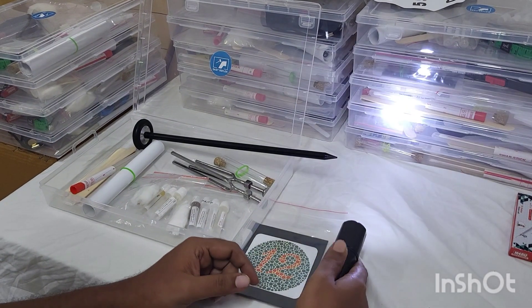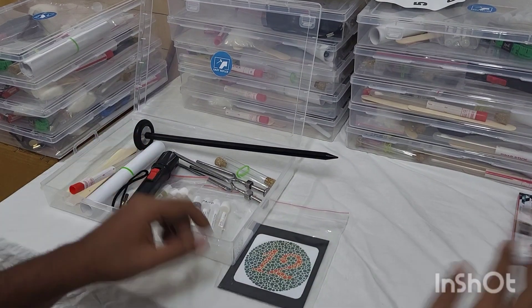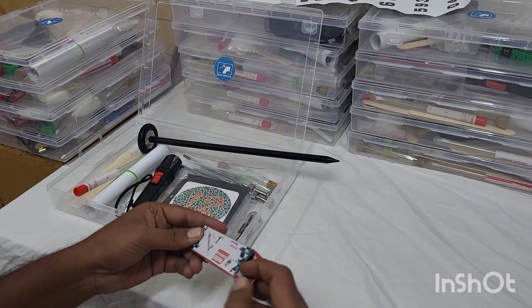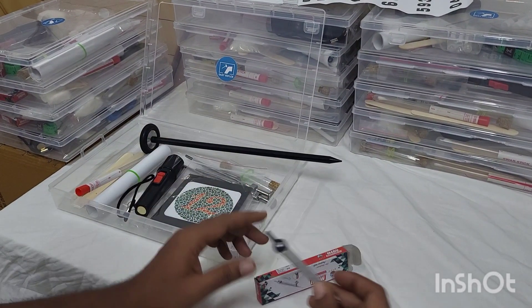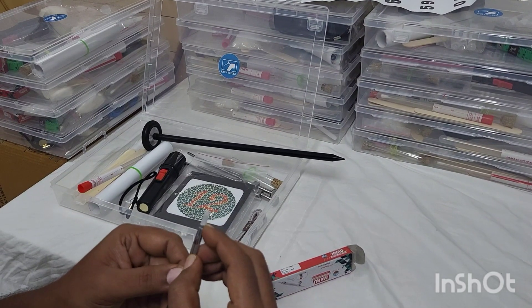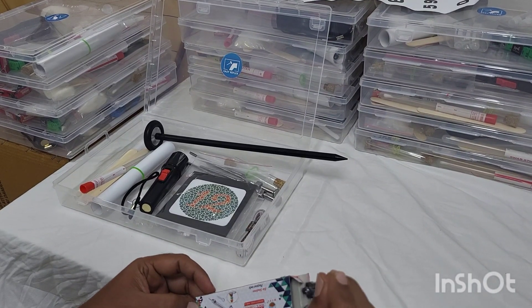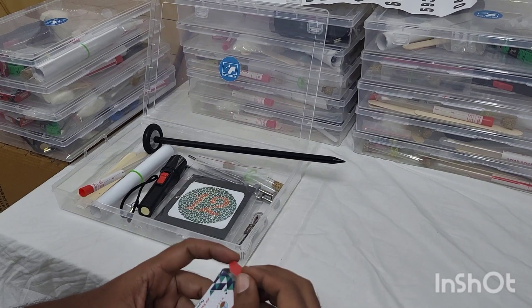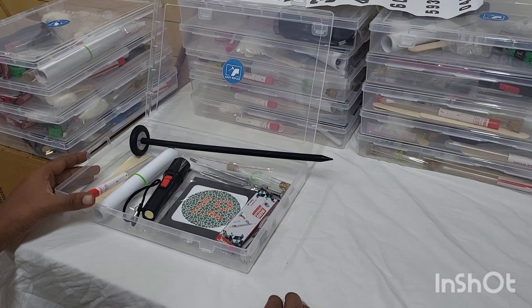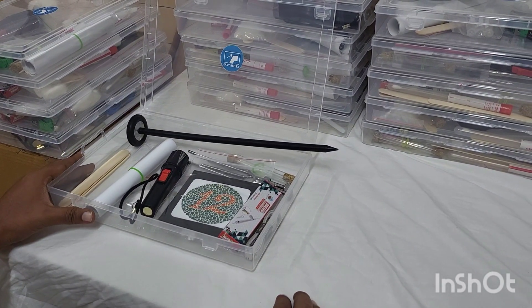Next we have a small torch light for direct and consensual light reflex, and we have an inch tape for bulk testing. Next we have given a divider for two-point discrimination, which is a cortical sensation. We have also closed the sharp pointed tips with plastic caps so that it doesn't produce pain sensation and helps only in two-point discrimination. You can buy this entire kit by contacting us on WhatsApp or you can get the kit online. Thank you.